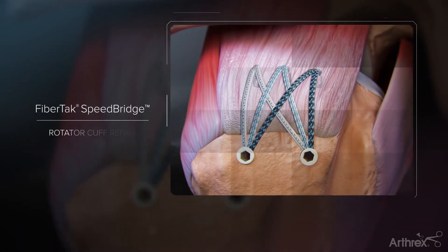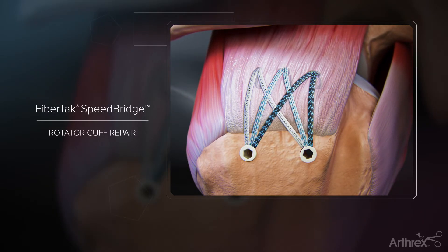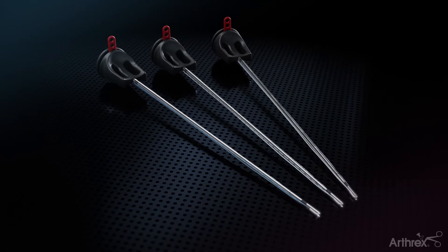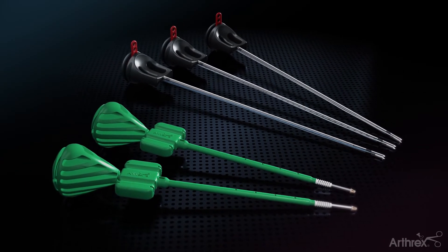The FibreTac Speed Bridge is a knotless double-row rotator cuff repair technique that provides improved footprint contact and compression compared to traditional techniques. This procedure is completed with 2.6 FibreTac RC soft anchors on the medial row and secured laterally with trusted swivel lock anchors.